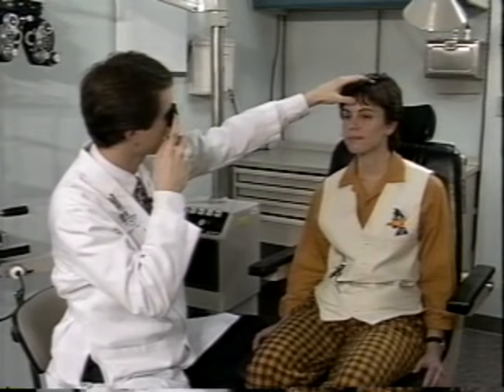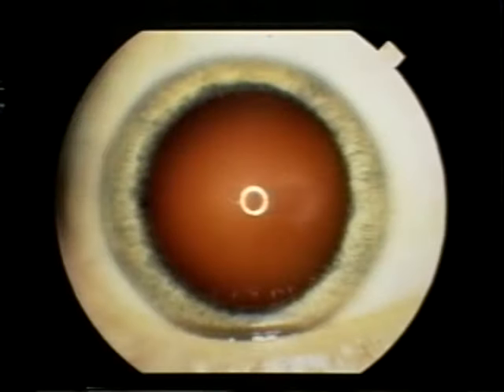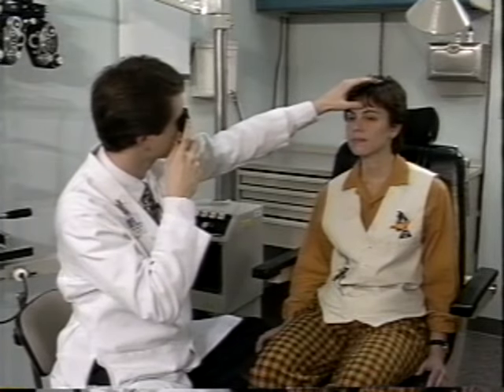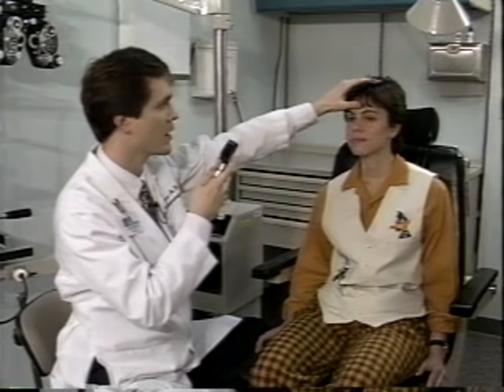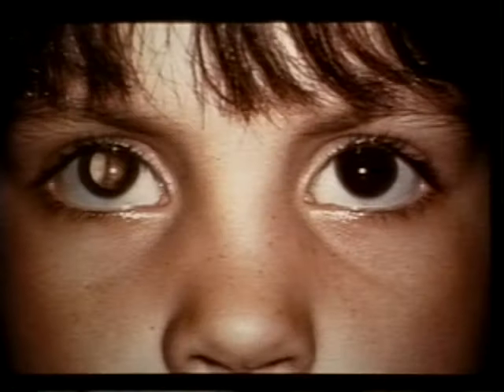First, at arm's length, focus on the front part of your patient's eyes, looking for a normal red reflex. A normal red reflex indicates that there's no obstruction between you and your patient's retina. I prefer to put my hand on my patient's forehead, both to stabilize their head and prevent me from bumping into them as I move closer.